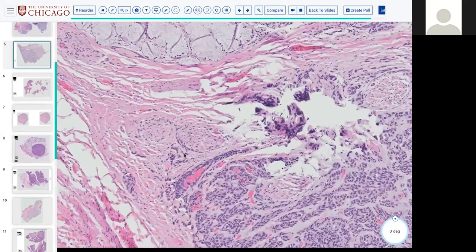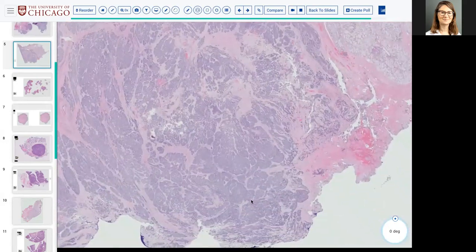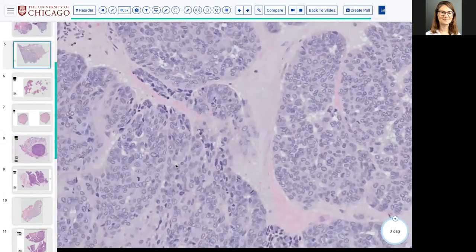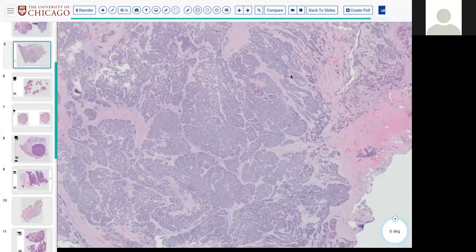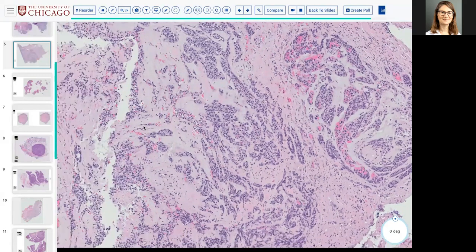So based on this morphology, this definitely looks like a carcinoma. My differentials were either adenoid cystic, maybe more solid adenoid cystic, or polymorphous adenocarcinoma. There are mitotic figures in this as well. I think we can differentiate between the two just by doing P40, because adenoid cystic is biphasic and polymorphous is not. So that's what I thought about this case. Awesome. Yeah, that's very good.